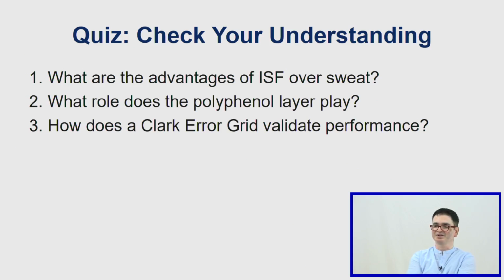You can take turns. That's fine. Ladies first is always good policy. People would not like to sweat every time. Good. Nice. Sweat volume is low, not everybody sweats a lot, particularly if somebody has a lot of body hair. Well done. Taking a sample is difficult. I mean, not difficult, it's minimally invasive, but it's not non-invasive. It's relatively difficult.